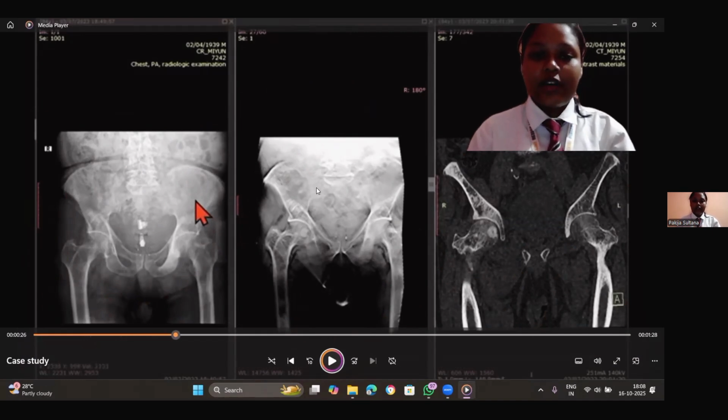An 84-year-old patient arrives in the emergency department after a fall. The suspicion is hip fracture, but early and precise diagnosis is critical, not just for treatment but for preventing complications. In this case study we will explore how next-generation imaging technology supports clinicians in diagnosing hip fracture with lower dose and enhanced clarity.